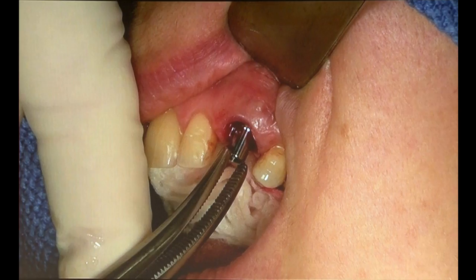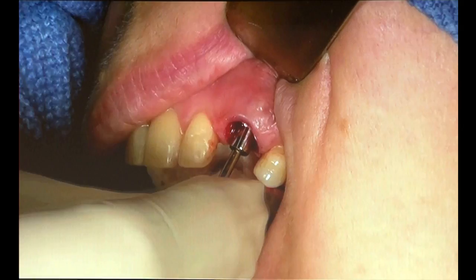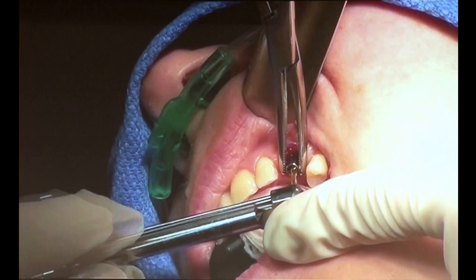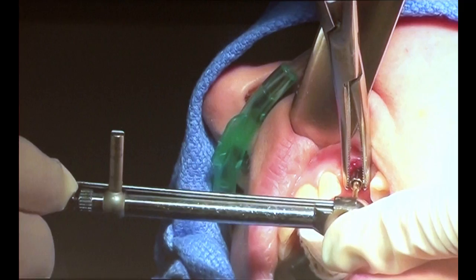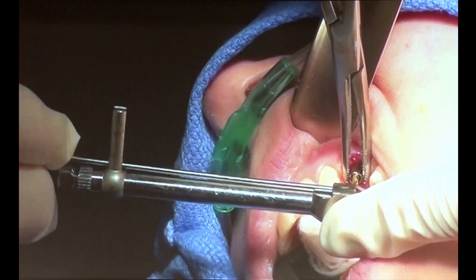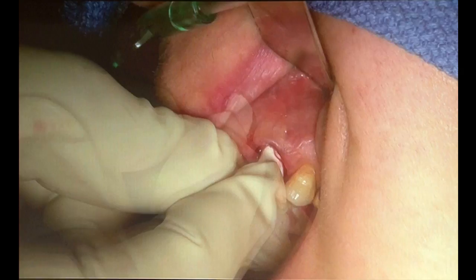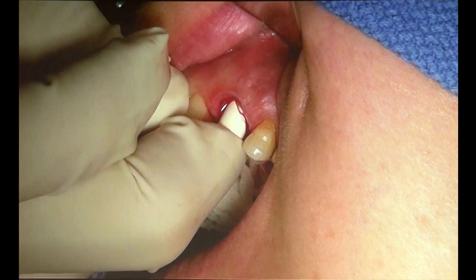rotation on this because at the initial placement, you don't want to over torque and perhaps loosen or seat that implant deeper. And so I'll hand tighten the abutment screw, take a hemostat, and give some resistance to this torque of the abutment screw. Because the one thing you do not want occurring when you're provisionalizing is that abutment screw loosening with time. Because as was pointed out already, the critical period I feel, and I agree with our previous speaker, that the critical period is really the first 4 weeks.